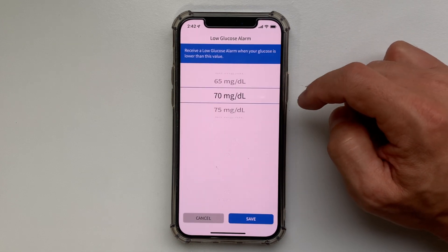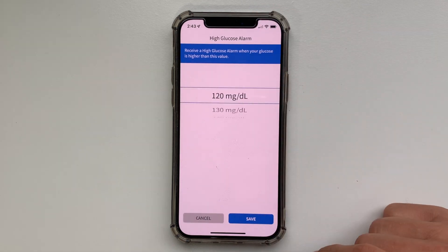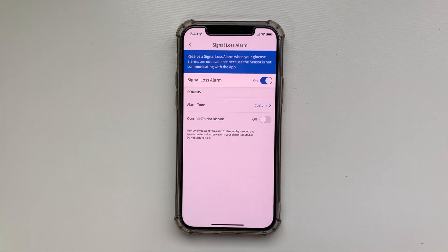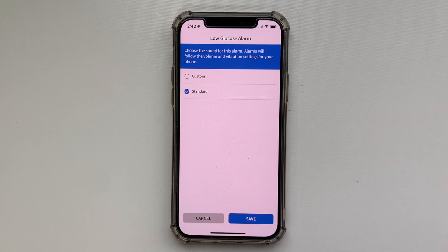You can set your low glucose alarm anywhere between 60 and 100 mg/dL, your high glucose alarm anywhere between 120 and 400, and you can activate the signal loss alarm, which will warn you when your phone is not able to receive data from the sensor — typically when the phone is in another room. All these alarms can be turned on and off anytime, and you can choose two different sounds.